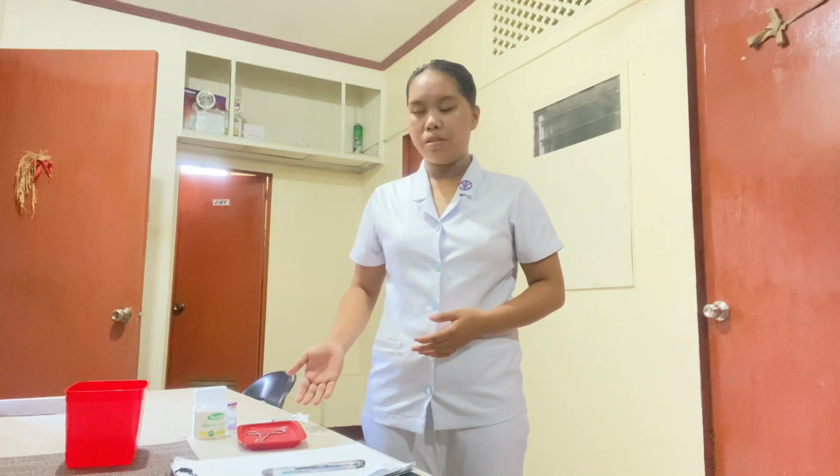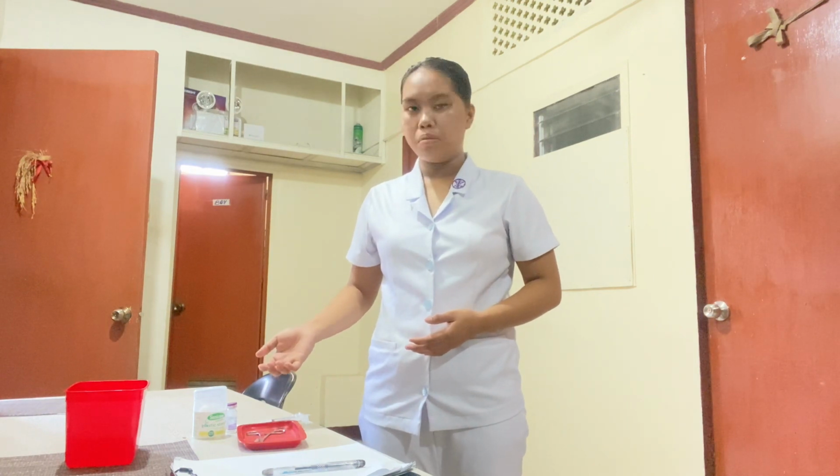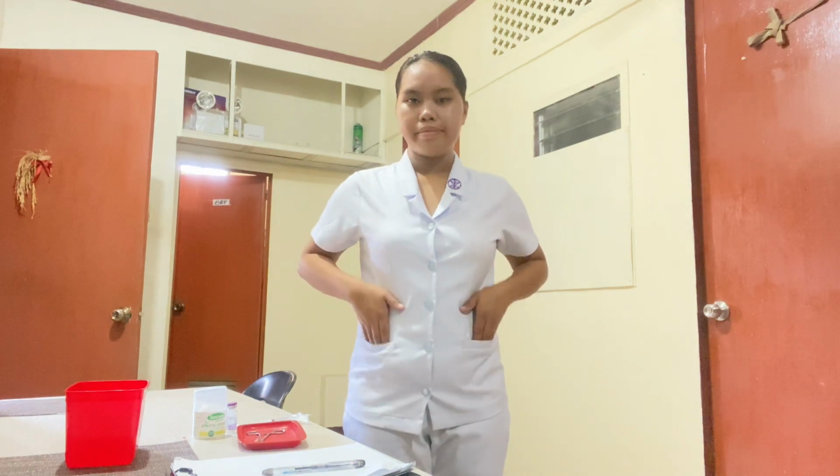I have here a syringe, forceps, aspirating needle, medication tray, a vial, a 70% alcohol solution, a cotton ball, and last one is a garbage bin. Perform hand hygiene to deter the spread of microorganisms and also observe the other infection prevention procedures.